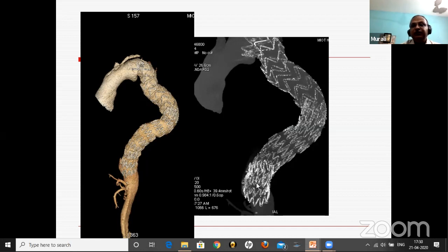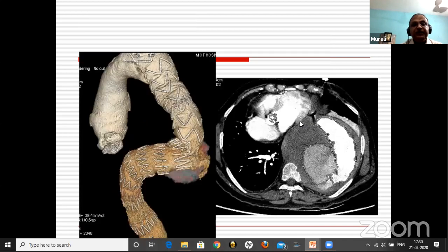We know that there is a lot of problem for us on the day to push and pull. I thought the second graft could have started somewhere here. It had just landed here, but still it had almost an overlap of 3 stents. Looking fine, I thought, but anyhow, we thought we'll do an early follow-up, and that is what happened.